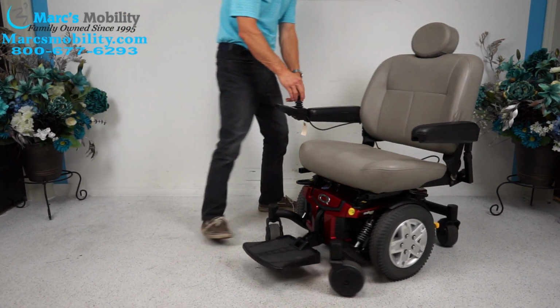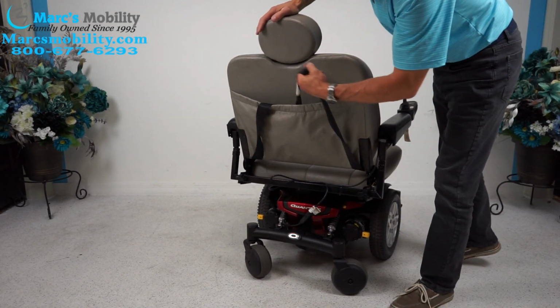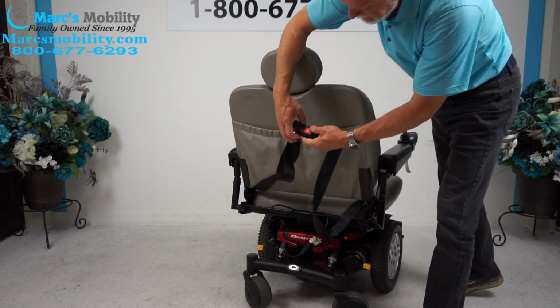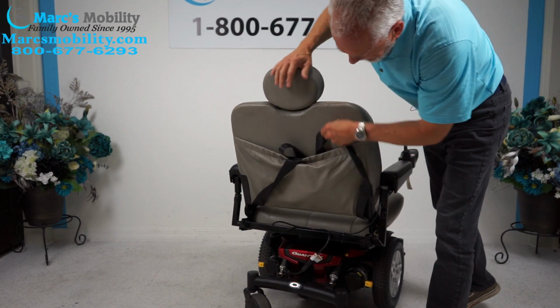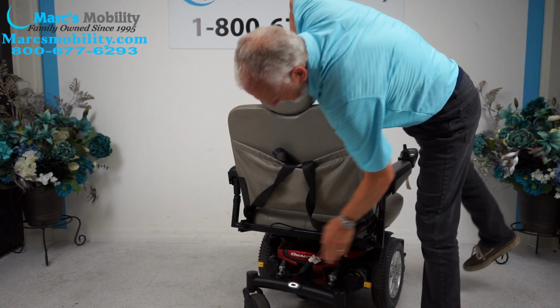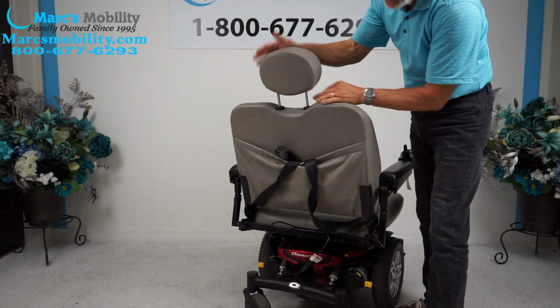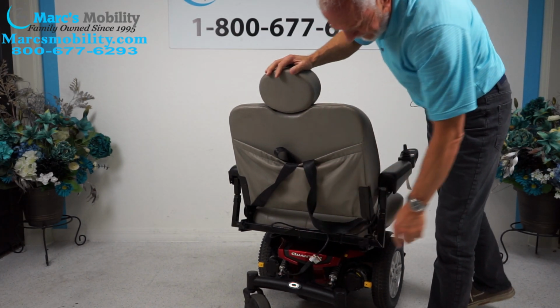The back of the chair. You have your safety belt. And you can see the back of the chair. This is how you adjust your arms, right here and right here. And you have an adjustable headrest over here. Okay, and you can see the back fork on the chair.